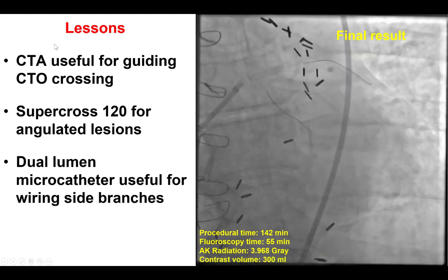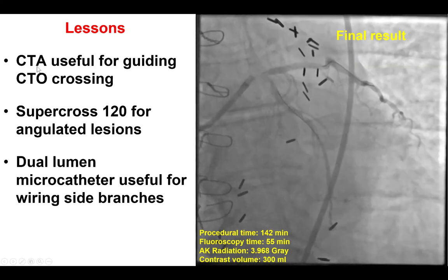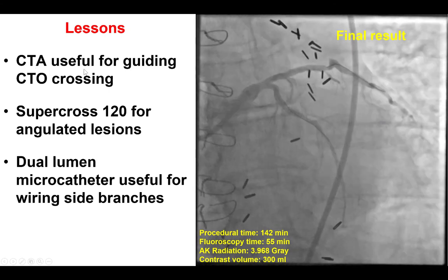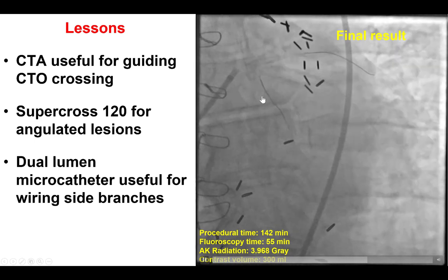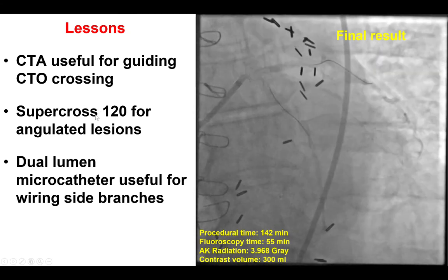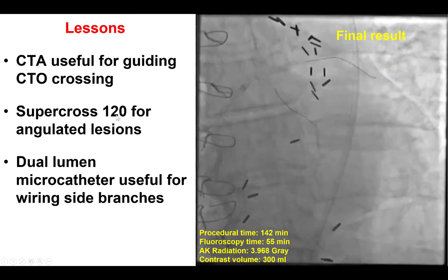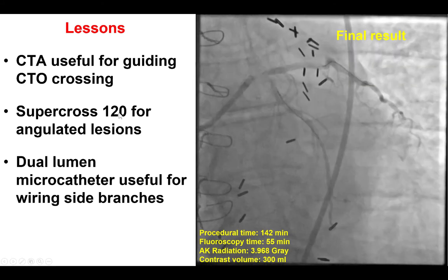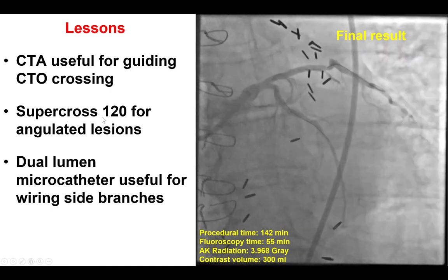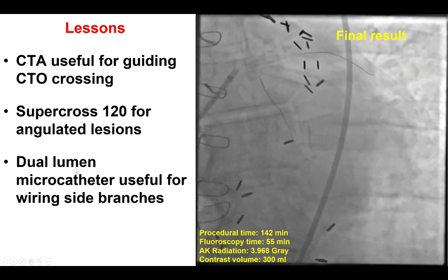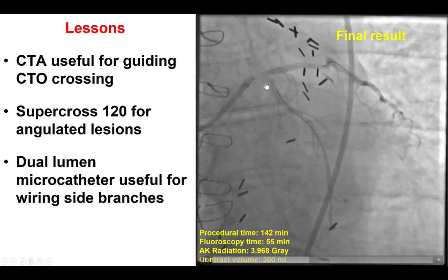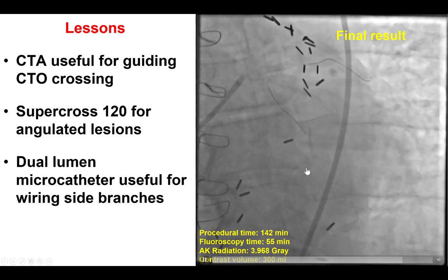This case highlights the importance of having guidance in cases of ambiguous proximal cap. CT angiography co-registration did help us cross into the CTO. Also, the use of an angulated microcatheter was very important in pointing us towards the proximal cap — in this case the Supercross 120. The Venture catheter can be used as well for the same purpose and can provide good support, but it was on recall and not available at the time of this procedure. Finally, use of a dual-lumen microcatheter is a good solution for wiring side branches without losing access of the wire that has crossed into the distal true lumen.